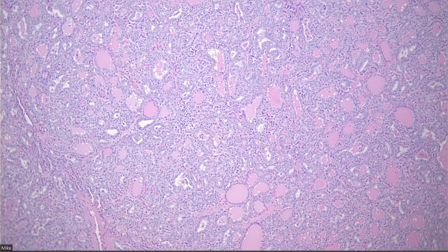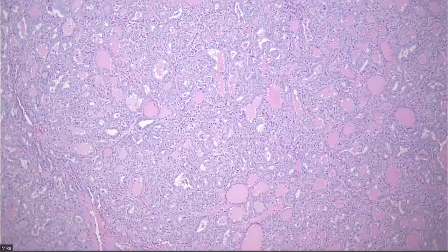So I don't know if BRAF, and this is one of the things I want to look at in our population: is BRAF V600E really worse, or is it just artifactually worse because we had all these RAS tumors in there? The only fusion that is not theoretically good prognosis is NTRK fusion. So the NTRK 1 or 3 rearranged PTCs are thought to actually be somewhat biologically aggressive for reasons that we don't understand.